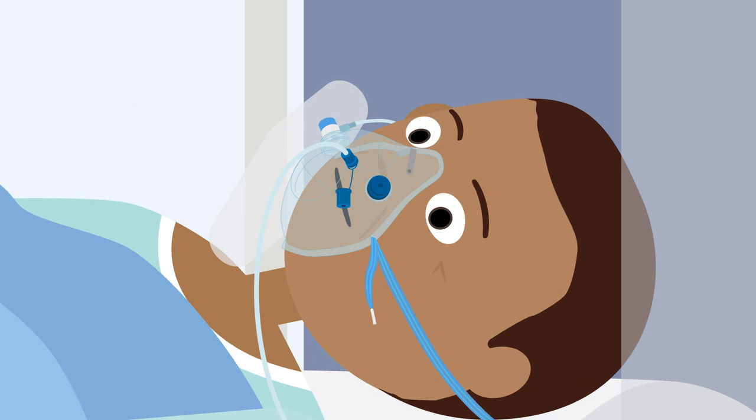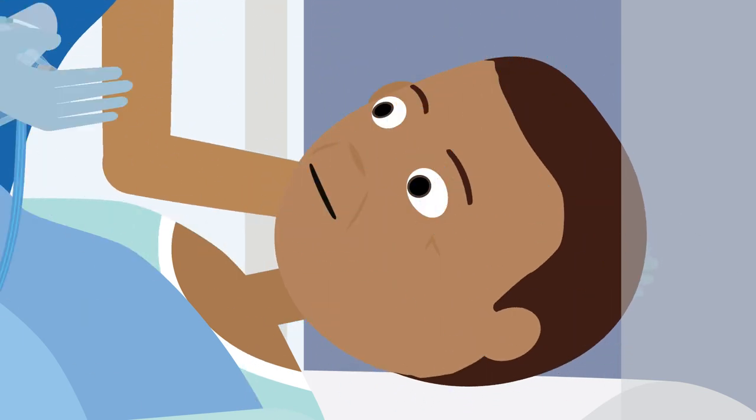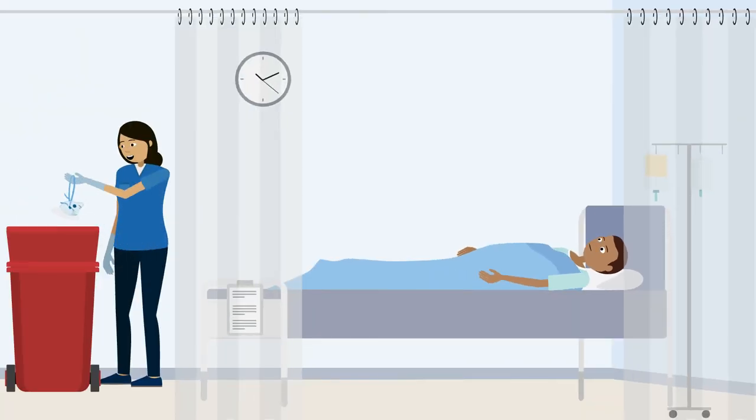The mask should remain in use until the patient has adequately awoken and oxygen saturation is deemed acceptable.